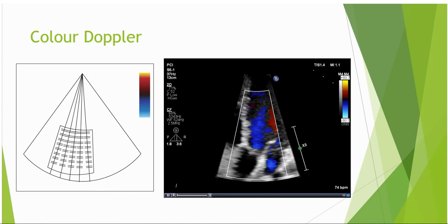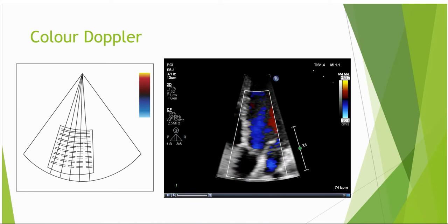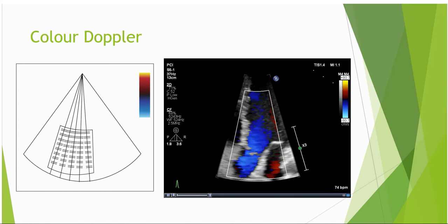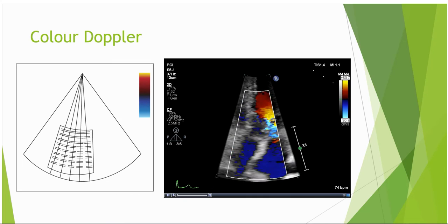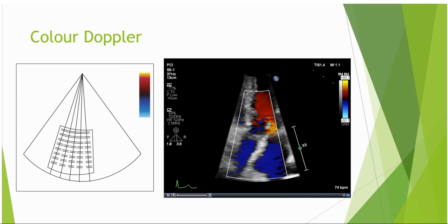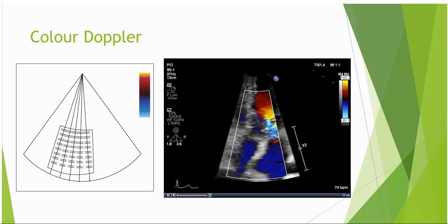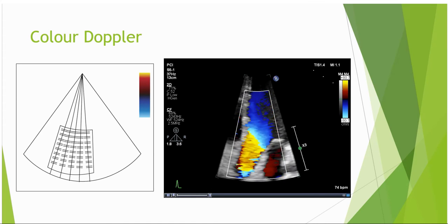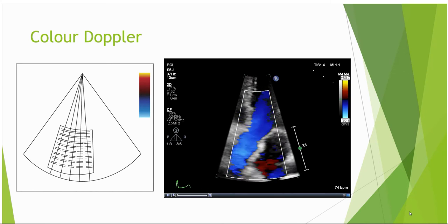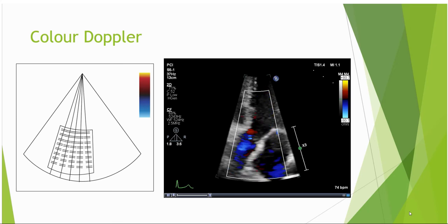Color Doppler is another application of pulsed wave Doppler, which is however different from its original mode. The color box appears as an overlay of the 2D image, and the machine works by alternating lines of sight with both pulse wave and 2D. In addition, we must collect more than one sample volume down each line of sight. We are sampling a range of Doppler shifts rather than at one specific point. As mentioned on previous slides on frame rate, the system is performing these multiple tasks and this has a significant impact on the frame rate that we see in the display. So we can see how many of the functions of the system are interlinked, and adjusting one function may have impacts on other settings of the machine.